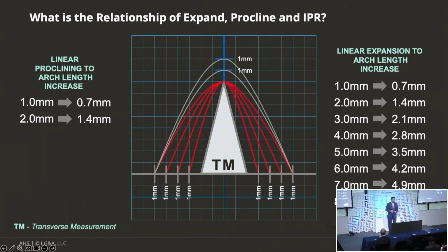One way you could go about doing this is you could take a baby step, which is send in your cases, you get the treatment plan back, there's some IPR there, you could look at it, then you could send back and say, please expand away the IPR. There's nothing wrong with that. Another way to do it is, after a while, if you feel comfortable, well, I've been doing this now for 10 or 20 cases or a year later, I don't want to take the extra step. Then you submit your cases and you check off the box, no IPR.